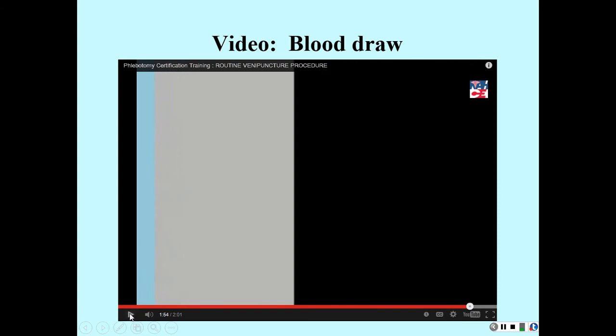Okay. So the thing that makes that a little tad easier is you're not trying to thread it. As soon as you get blood or you feel that you're in the vein, you can stop advancing your needle. You don't have to thread anything all the way through. Yes, it will automatically stop when the pressure equalizes in there.